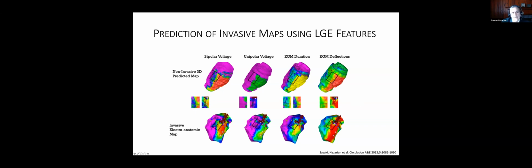And I want to point out that the maps that you can create from images have a lot more information, right? These have information for the full 360-degree view with tons of voxels, if you actually count the voxels of information that are available. And even with our current high density mapping, the maps will not be as dense and information filled as these images. So they can be quite useful, and they actually match information obtained actively in the lab quite well.